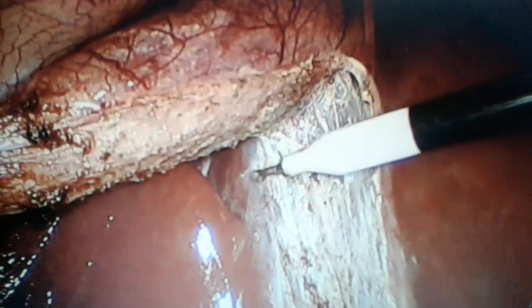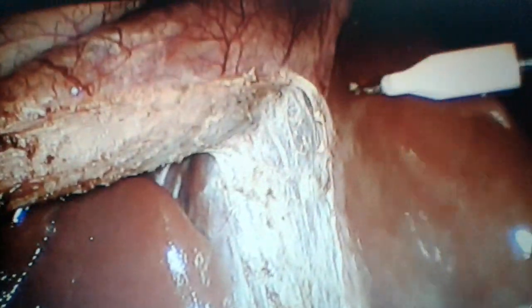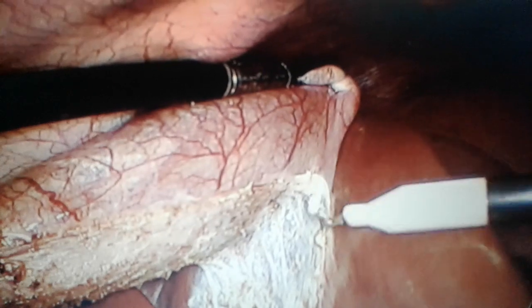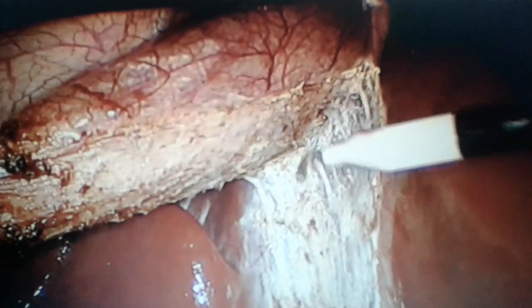Again, the pushing of the tissue towards the gallbladder. Almost half of the gallbladder dissected out of the gallbladder fossa. The uppermost instrument is known as atraumatic grasper, fenestrated, single joint atraumatic grasper.